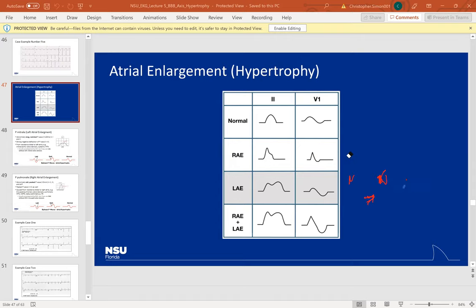Sometimes in left atrial enlargement you get an M-shaped P-wave in lead II. That's true — you might see it — but you also might not, so you can't rely solely on that. It's like rabbit ears in right bundle branch block: you might see them, but you also might not. Don't rely on that pattern alone or you might miss it.